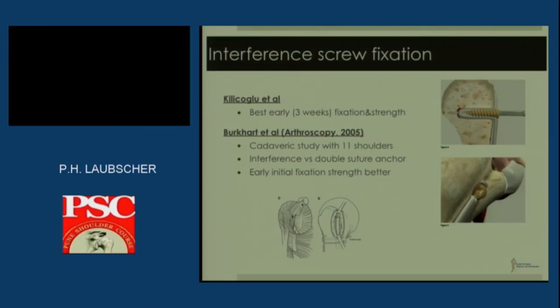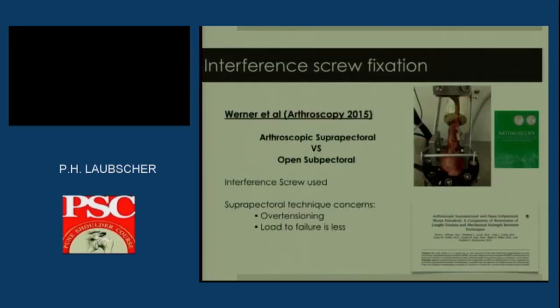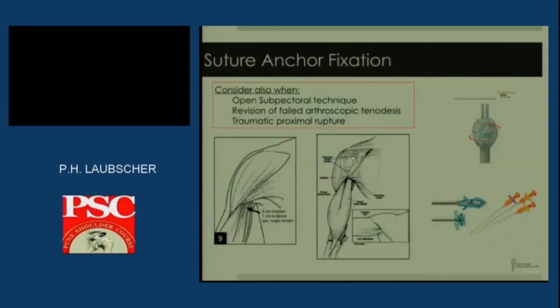This is a technique that I've used in the past, and I've always been concerned about cutting of the tendon when I'm inserting my interference screw, and I've been disappointed that my tension isn't that good either. So I've moved away from this technique, even though studies have shown that the interference screw technique is a very strong fixation. So notwithstanding the strength of it, I still prefer the technique that I use.